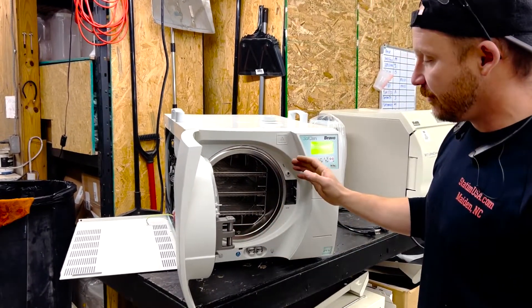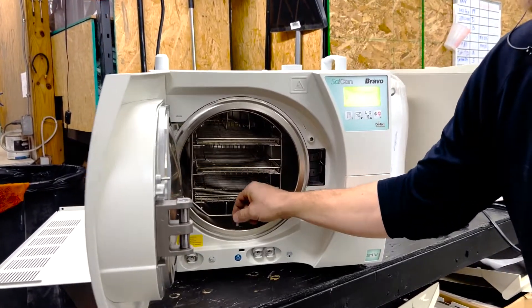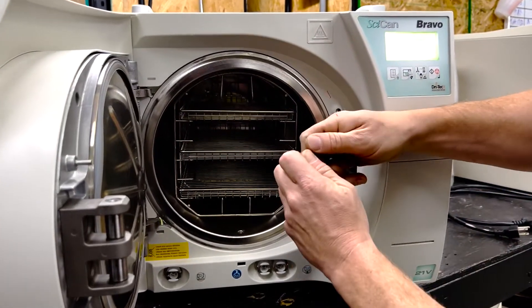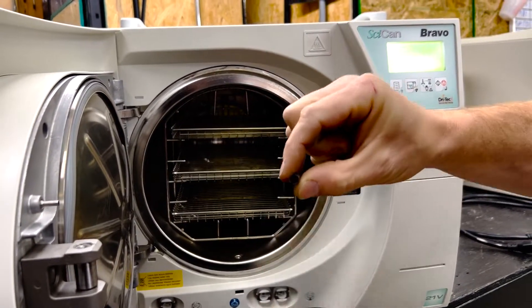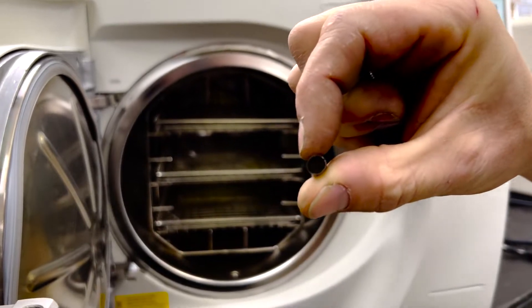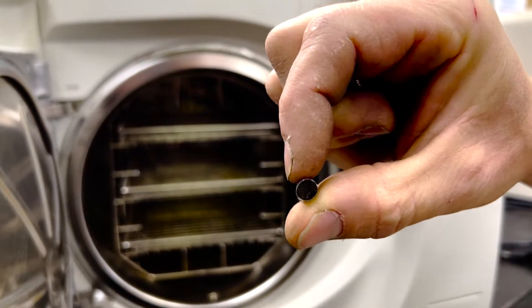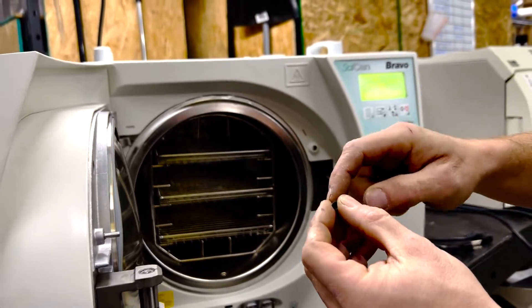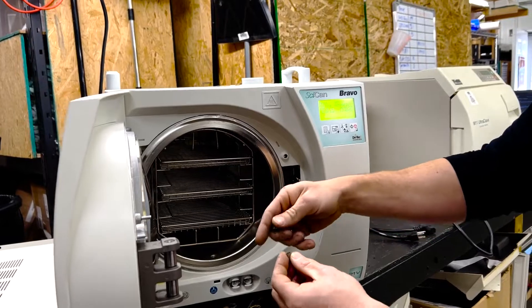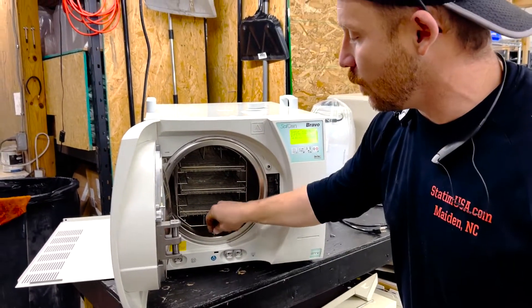Another preventative maintenance item is this chamber filter right here. It unscrews like so. From there, what you would do is just hold this up to the light and make sure that you can see through it. A lot of times there's lint — on this one there was a nice big ball of lint — and this is where it evacuates water from. So if that's clogged, it can't suck the water out.